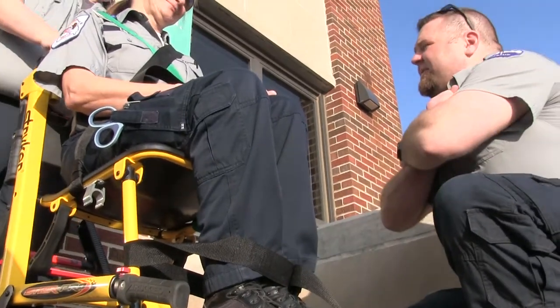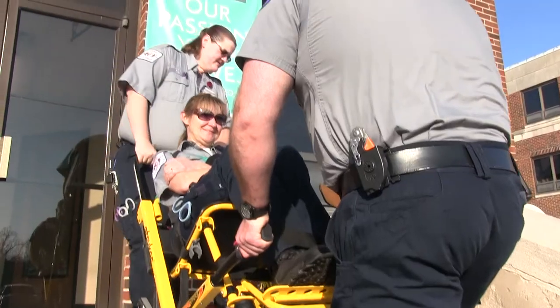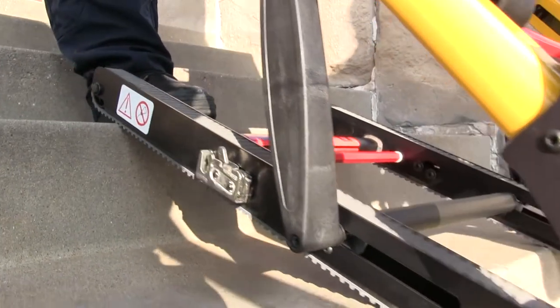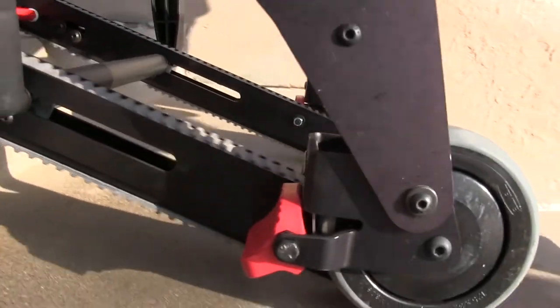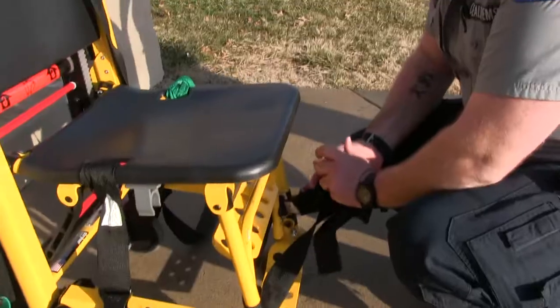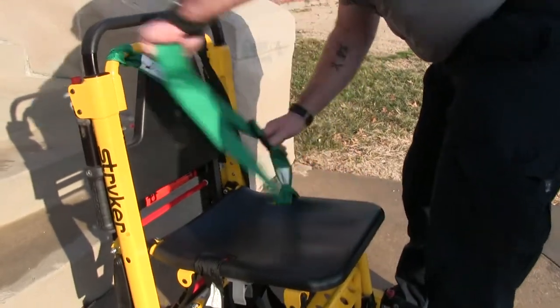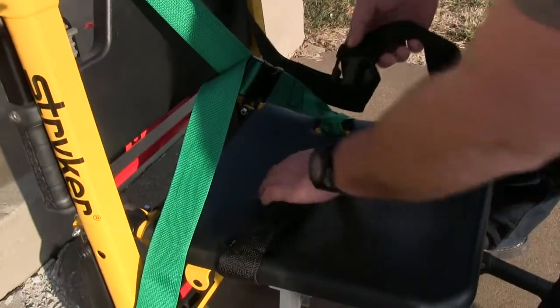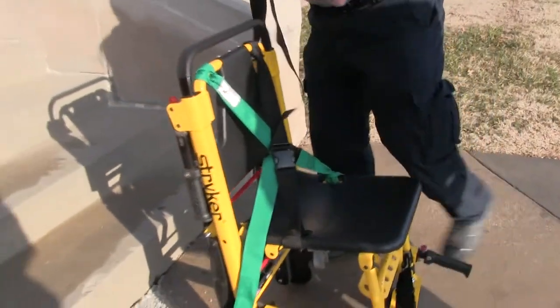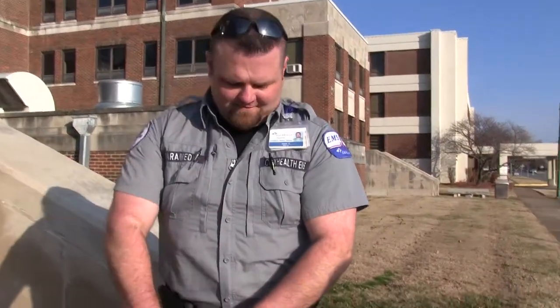When we're going down, try to give yourself a hug. Don't reach out and grab anything. There we go.